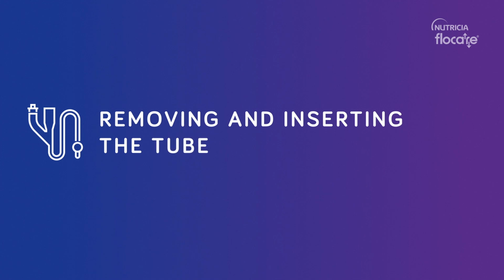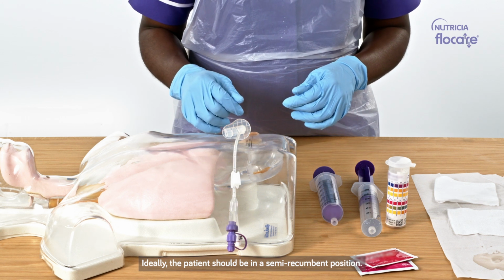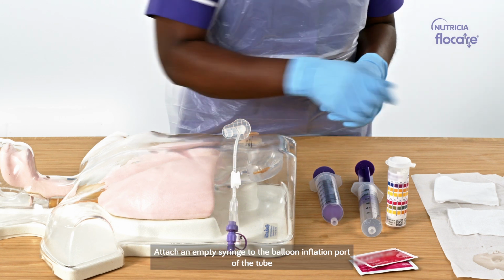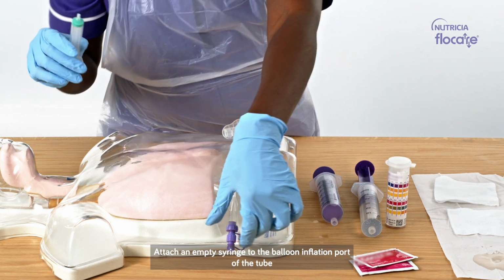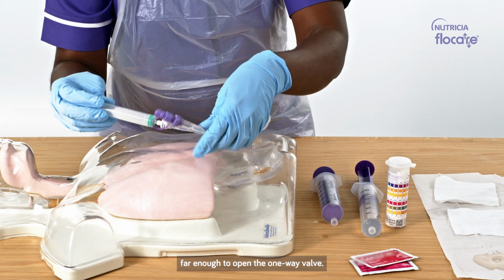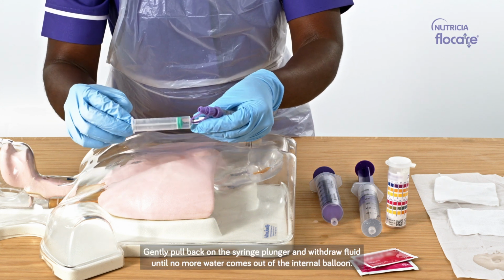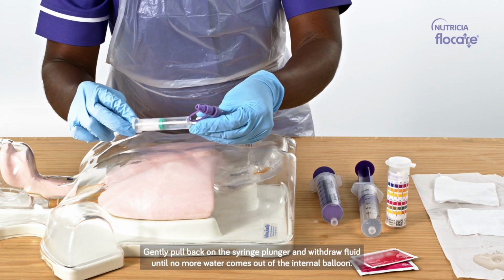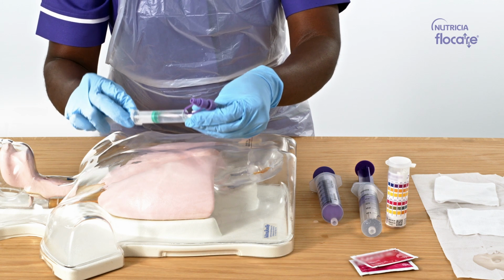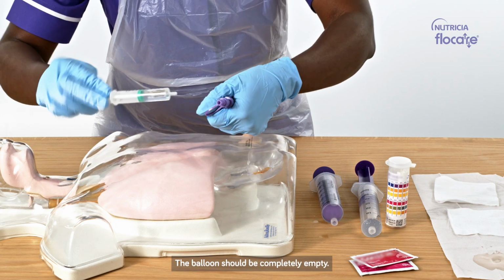Removing and inserting the tube. Ideally, the patient should be in a semi-recumbent position. Attach an empty syringe to the balloon inflation port of the tube, far enough to open the one-way valve. Gently pull back on the syringe plunger and withdraw fluid until no more water comes out of the internal balloon. The balloon should be completely empty.